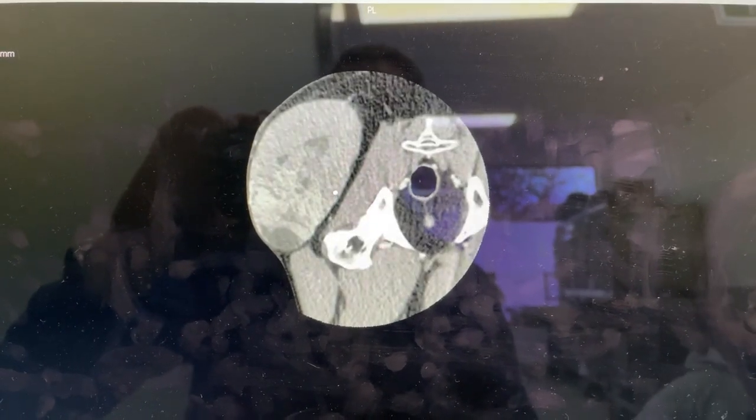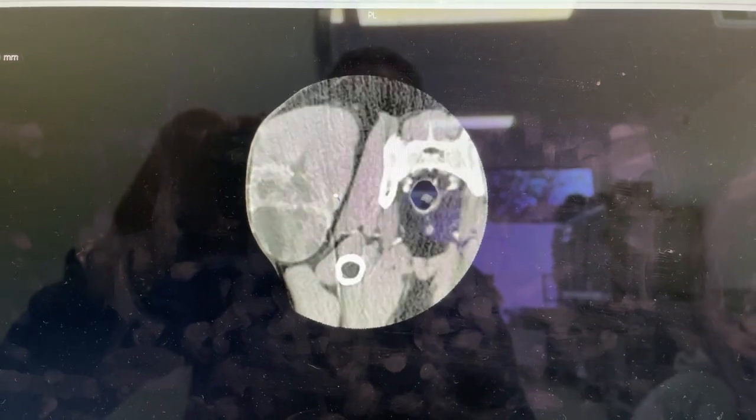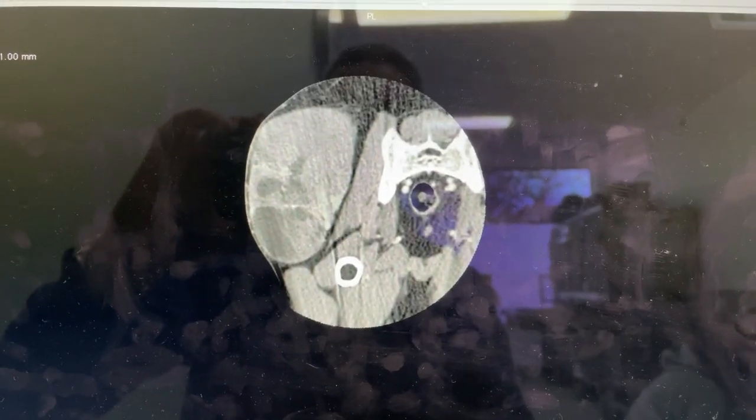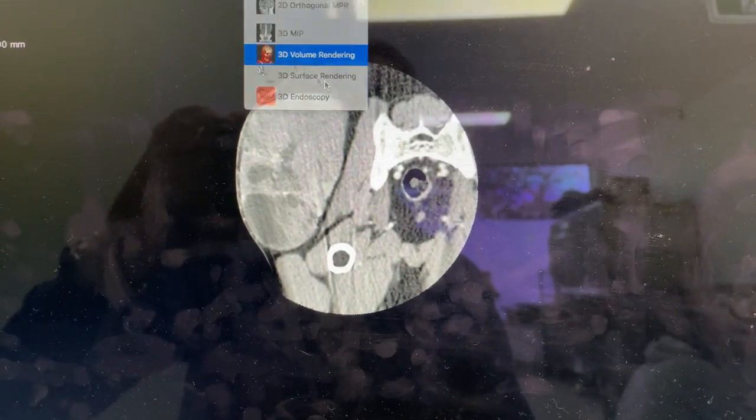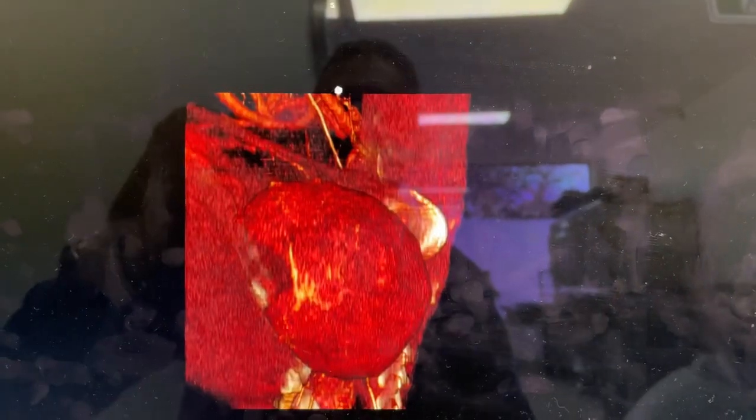So I'll just do a 3D color volume rendering and turn down the brightness a little bit.